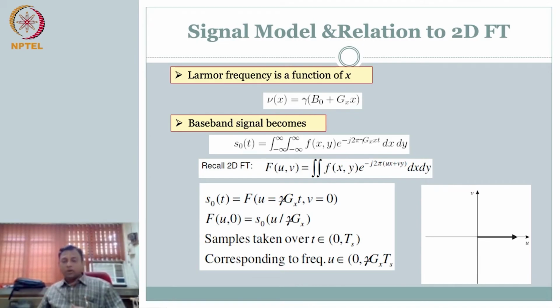Fantastic, right? Now you recall something similar we did in 2D CT. You had a detector array, and a famous theorem, the Fourier slice theorem. You measure the signal on the detector array and take the Fourier transform, and the Fourier slice theorem said this is one slice in the 2D Fourier transform of the object. So our entire concept changed. We said, why don't we acquire several projections and therefore populate the Fourier space?